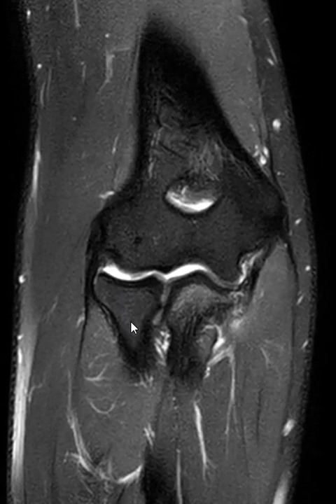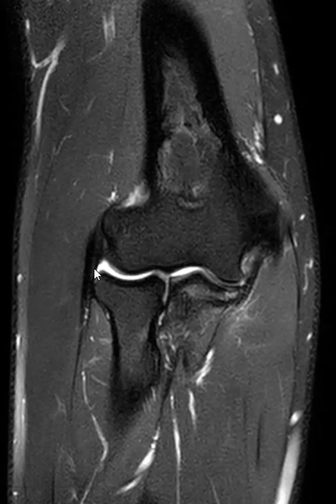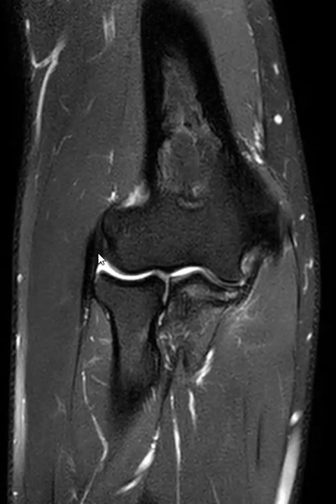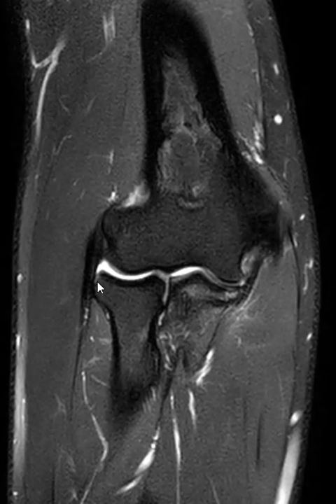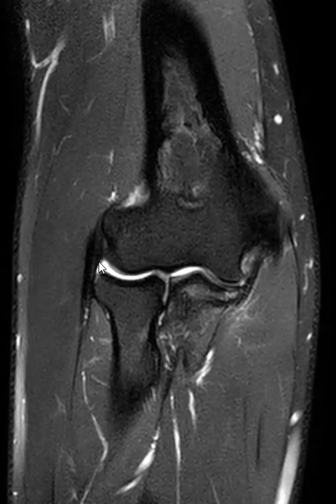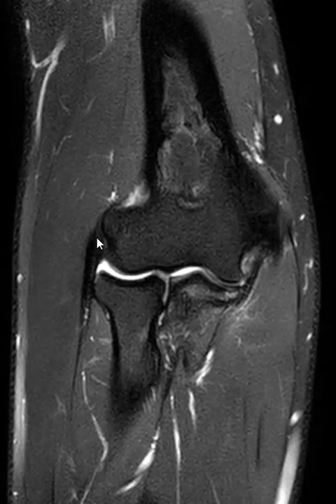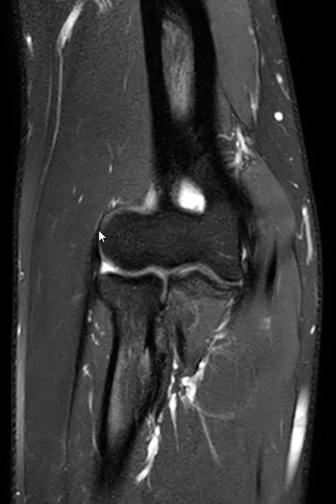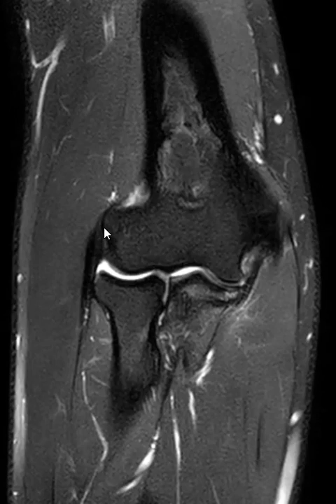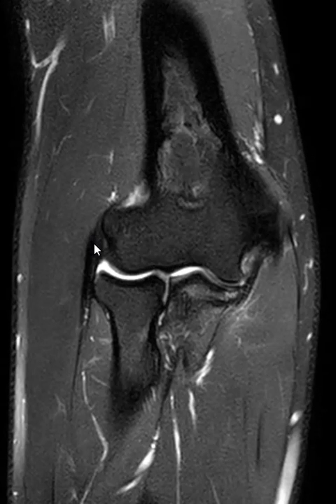We see the radius on the lateral side, and we see the lateral ulnar collateral and radial collateral ligament combined here together. We see overlying that the common extensor tendon complex coming up here to the lateral epicondyle, and all the lateral structures look good.